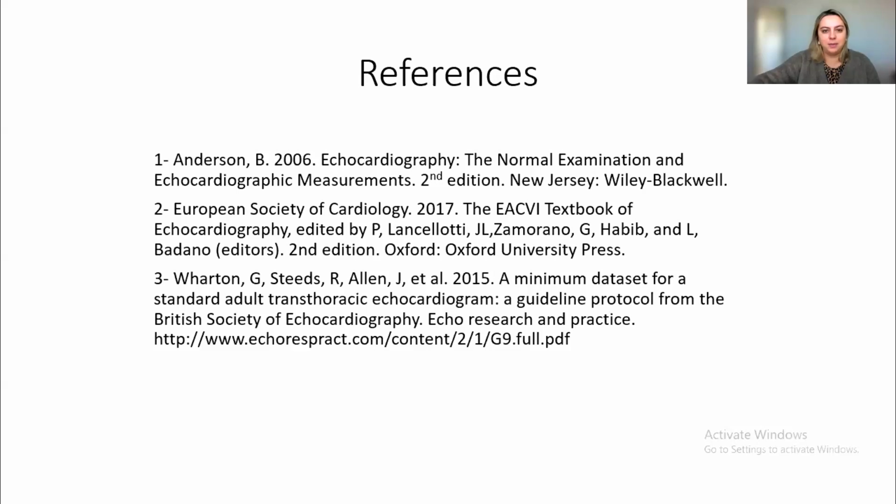All right. And we do have another last knowledge check. Same question. What is the name of this cardiac echo view? Four answers for you. Please choose the one that you think fits the most. Oh, I see people are responding real fast. About 50% of you responded. So let's see, maybe 10, 15 seconds.